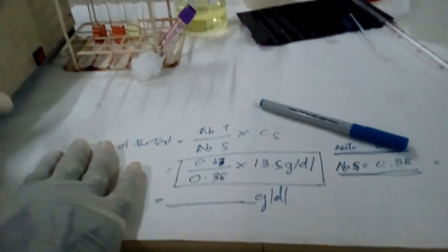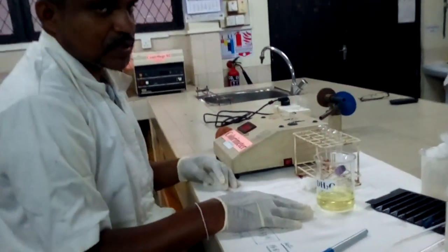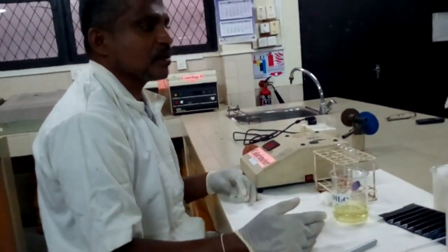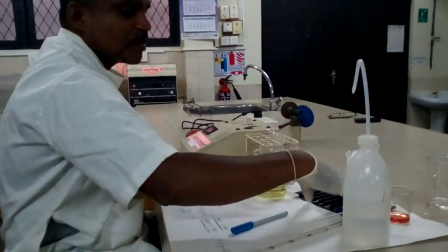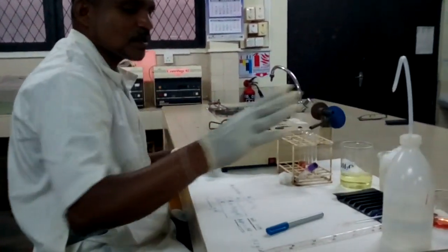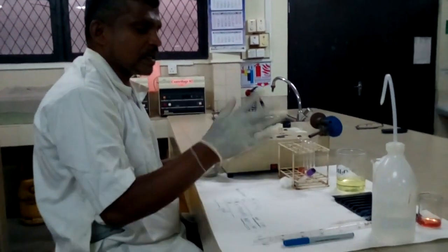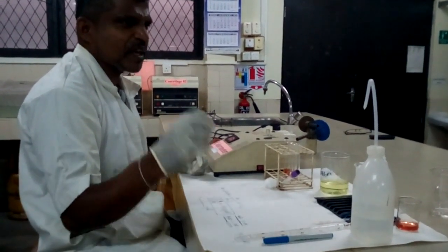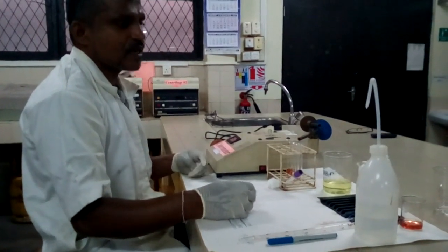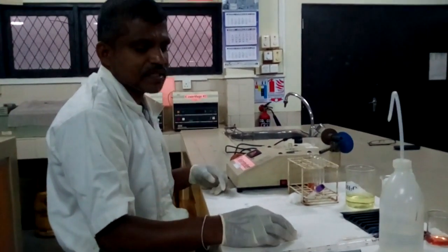Right, this is the procedure of the cyanmethemoglobin technique. Instead of the cyanmethemoglobin or the Drabkin reagent, in the oxyhemoglobin method we use ammonium hydroxide, which converts hemoglobin into oxyhemoglobin. The problem is that the produced oxyhemoglobin is not as stable as the cyanmethemoglobin, and also not all the hemoglobins are going to be converted into oxyhemoglobin. But in cyanmethemoglobin, almost all the hemoglobin is converted, except sulfhemoglobin, which is present in a very minute amount in the patient's body, and some people do not have sulfhemoglobin, which is a combination of sulfonamides and hemoglobin, right?